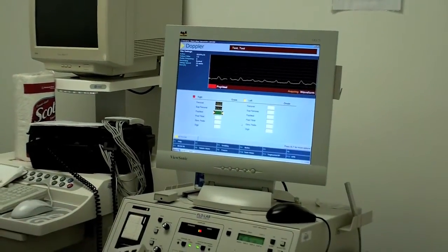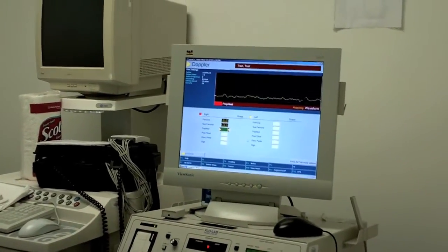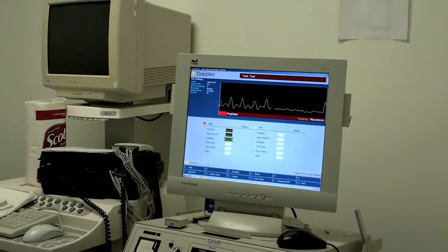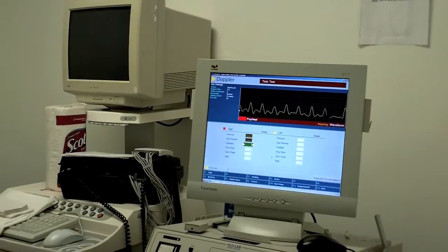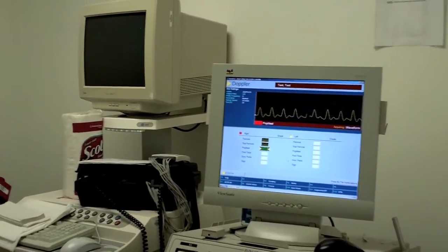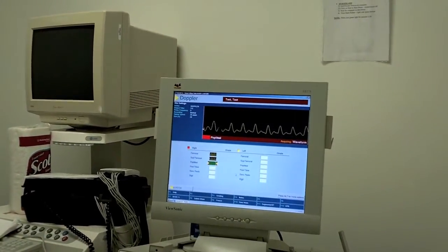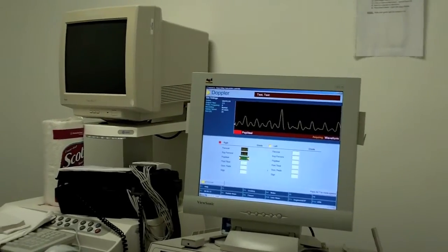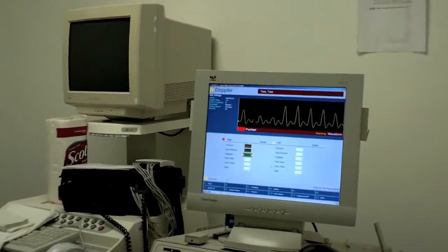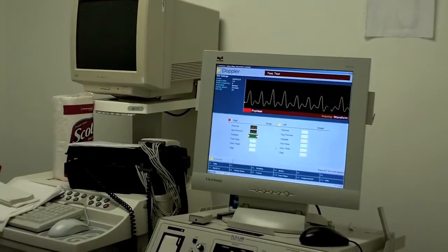I'm going to unmute it here, and again, listen as I'm slowly moving the probe medial to lateral or lateral to medial as I listen to find that. So now I found the vessel, and I'm going to readjust it until I hear that triphasic waveform, because I know I'm doing a fairly normal patient. Looking at the screen, I'm going to make the size a little bit bigger because I can hear nice. Okay, I didn't adjust the size, I just changed my window a little bit, and I got a nice triphasic waveform. Now I'm going to freeze and then save it.